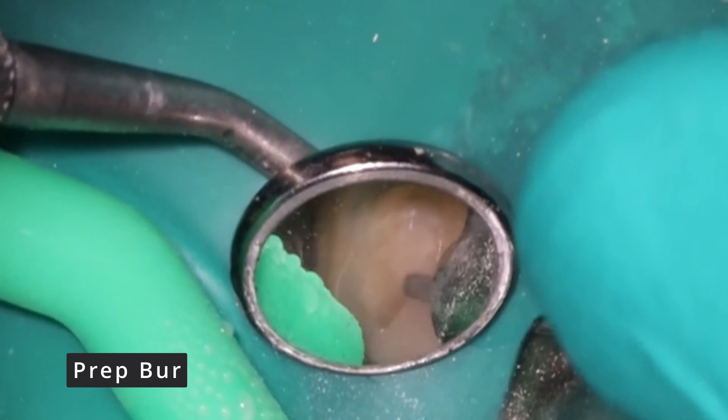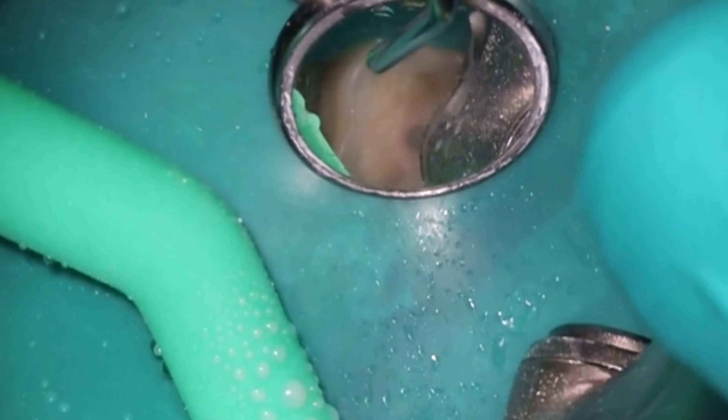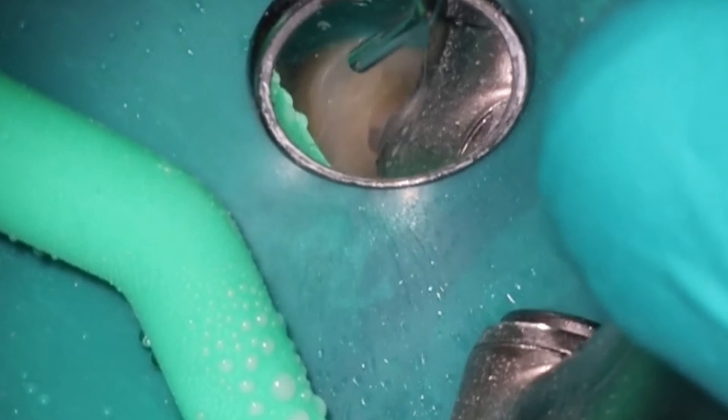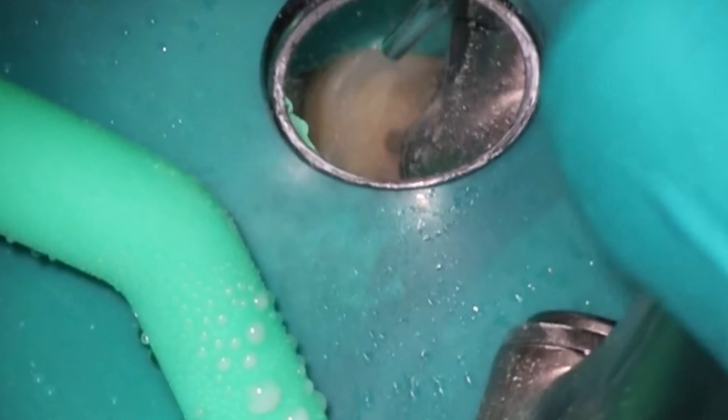Now we're going to go ahead and remove that existing composite. You'll notice I'm using the bigger diamond here for the prep bur, because it's a little more efficient in removing the larger chunks of composite. I will switch back to the infamous workhorse to access the tooth, and that's what we'll do to keep everything nice and conservative here.